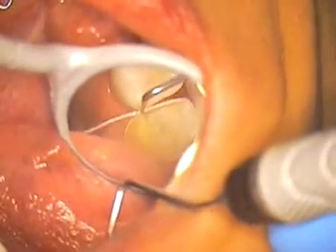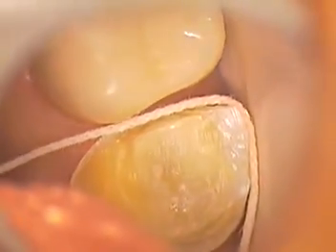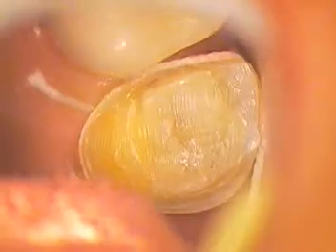Light air on the mirror. Okay, so wipe that, please. I get a wipe. Okay, so we're just gonna gently. We have another explorer. I like to use an explorer. I just think that we're able to get in without any trauma. It's nice to be able to just treat things very gently.